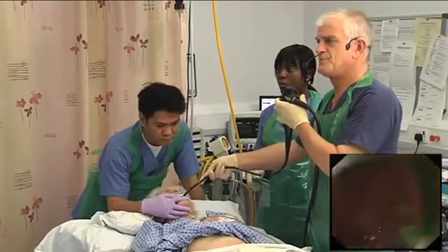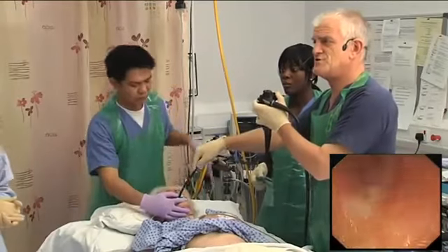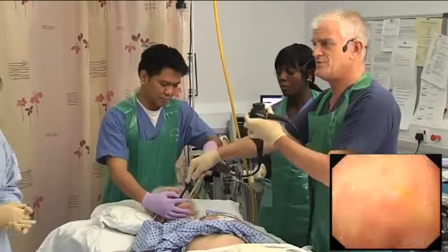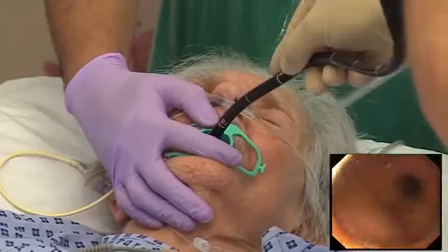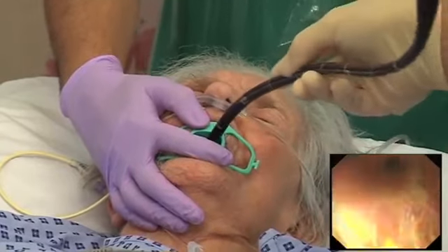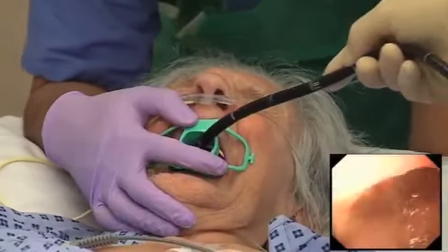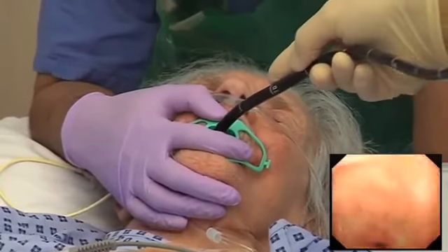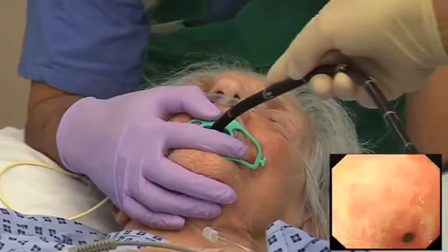Right. So we do a full upper GI endoscopy first. Although she's had no problems with her feed, we want to make sure there's no disease in the duodenum. That actually looks fine. Okay. So we'll come back now and choose a site just in the antrum and see if we can see the light up against the anterior abdominal wall.